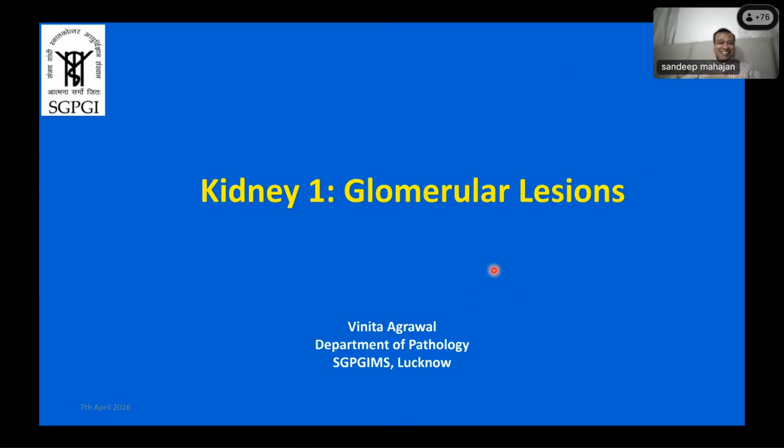Dr. Vinita, please. Yeah, thank you, Dr. Sandeep, for those words. So now we'll start with the session on pathology. I'll be talking basically about glomerular lesions. The plan is that I have already shared with you the cases, which are quite characteristic, to let you know how you approach a renal biopsy. I will start with how we process and approach a renal biopsy, and then we'll go to the cases. When we describe the cases, we'll talk of the common lesions and how we report them. So let's start. I hope my screen is visible to all.